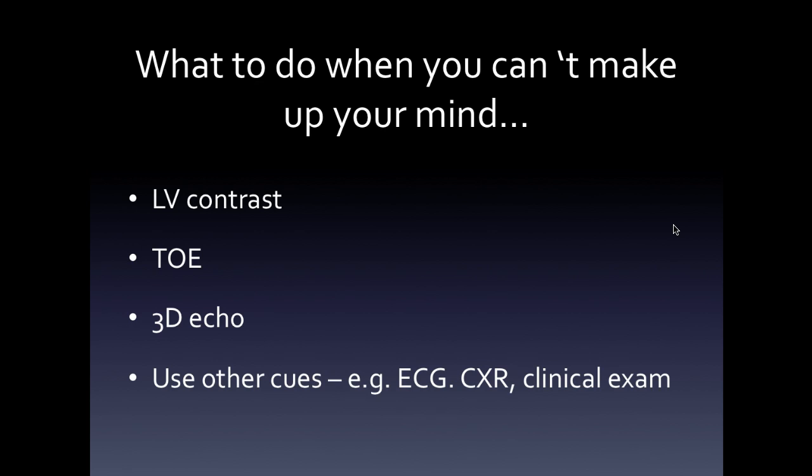So TOE, for those of you who use intraoperative TOE in the cardiac theatre, you're masters at it. But TOE, just for your first time on a Friday night at 10 o'clock, may not be the best time to start using the modality. And I'd emphasise actually interpreting the ECG, which you're probably much better at, taking the chest x-ray and, gosh, even the clinical exam, working that into your diagnostic algorithm can sometimes be as good as anything else will do.